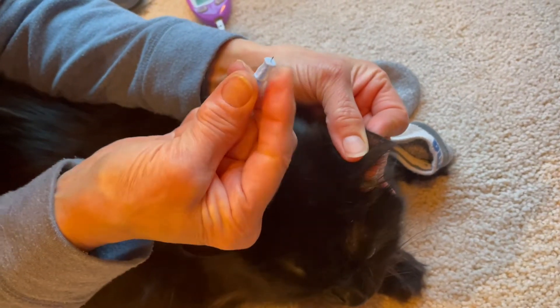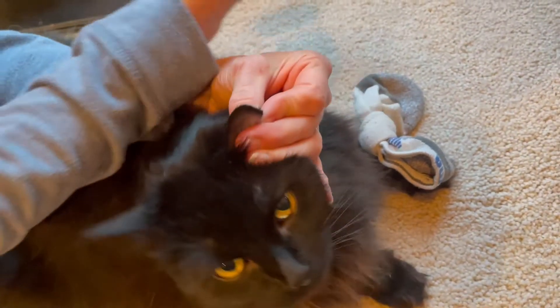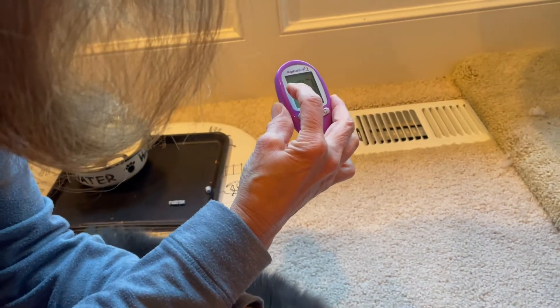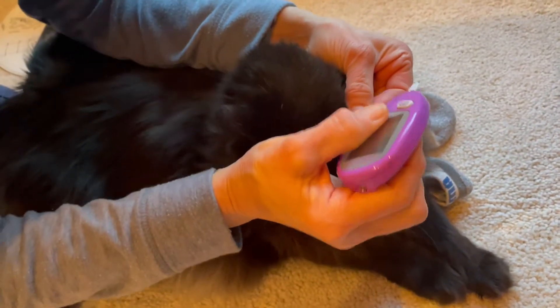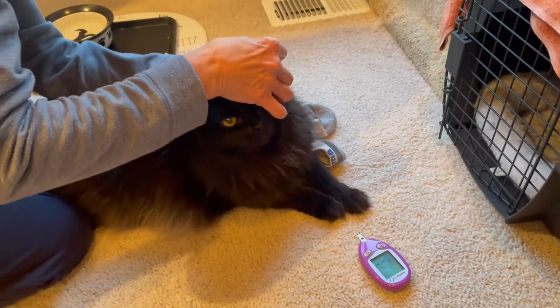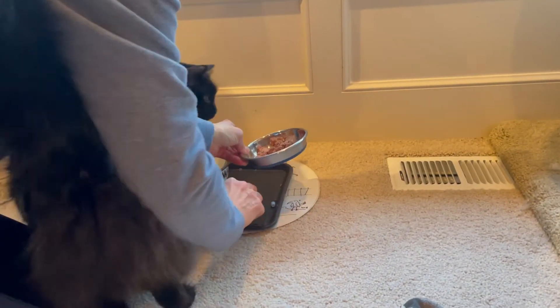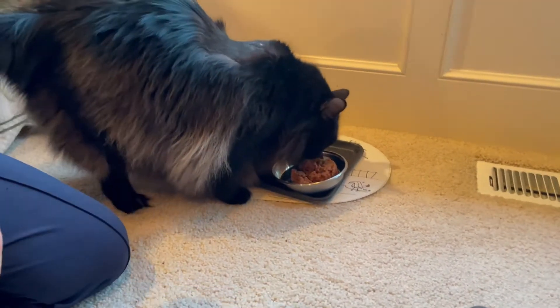I'm just going to give it a little poke. I'm waiting to see the little drop of blood — right there, now it's ready — so I just put it, hold still baby, and there it is. Now she's saying give me some food! Let's move your needle out of the way. And it's that easy — now she's very preoccupied with eating.